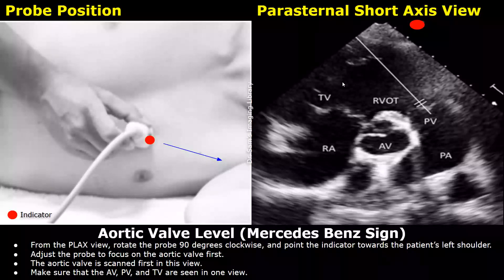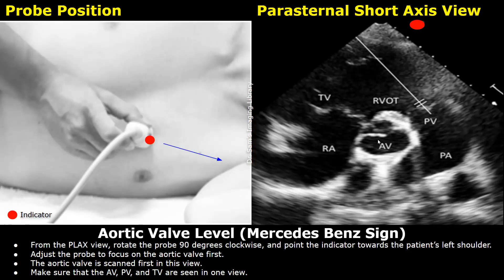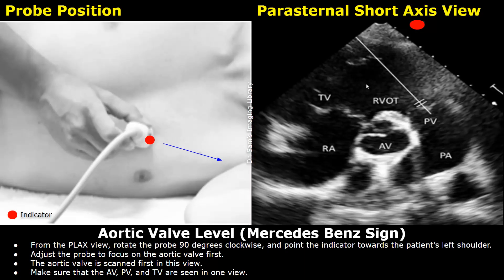Now we will look at the parasternal short axis views at different levels. The first level scanned is the aortic valve level, considered the starting point for short axis views. From the parasternal long axis view, rotate the probe 90 degrees clockwise to point the indicator towards the patient's left shoulder, then adjust with small sweeps, rotations, and angulations. You will see the aortic valve in the center — its cusps give an appearance similar to the Mercedes-Benz logo, called the Mercedes-Benz sign. The right atrium is to the left of the aortic valve, above which is the tricuspid valve, followed by the right ventricular outflow tract and pulmonary artery. The pulmonary valve is also seen here.